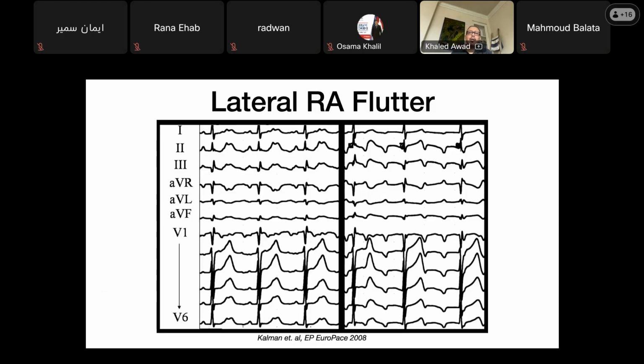Okay. Now, I thought focal atrial tachycardia is very helpful to understand these cardinal principles of how to use the EKG to tell you where an arrhythmia is coming from. These are P waves in patients who've had ablation in the right atrium. They had incisional flutters because of a prior surgical incision in the right atrium.